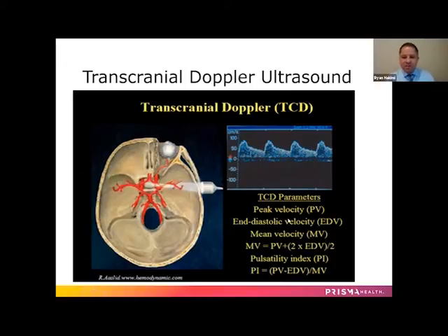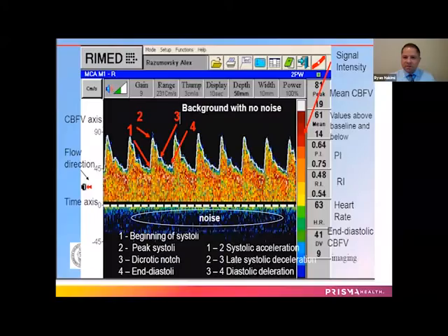You measure certain TCD parameters, which are then used to perform calculations by which you can then make your clinical decision making. So here, the most common one is the mean flow velocity, whose calculation is listed here. And that has been what's been validated for TCD. In contrast, for example, many of you may be familiar with carotid vascular imaging. In carotid imaging, it's the peak systolic velocity that has been validated, not the mean. So it's always important to remember to look at the mean flow velocity when we're talking about TCD.